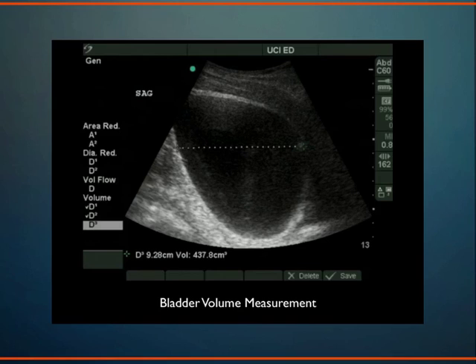There's a whole host of things I can see in the bladder: diverticulums, bladder tumors and masses, and thickening of the bladder wall consistent with cystitis. But just to measure the urine, there's also something called a post-void residual. Somebody who has an enlarged prostate thinks they've emptied their bladder, but instead we have 400 cc's left in the bladder after they attempt to void.